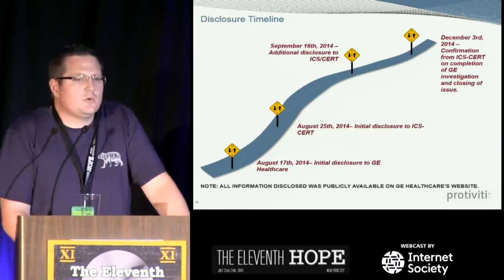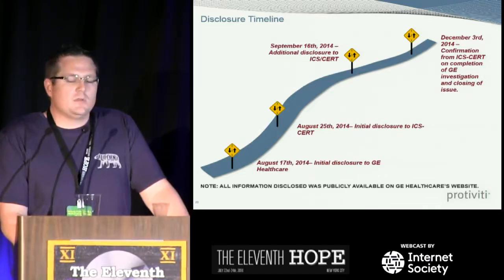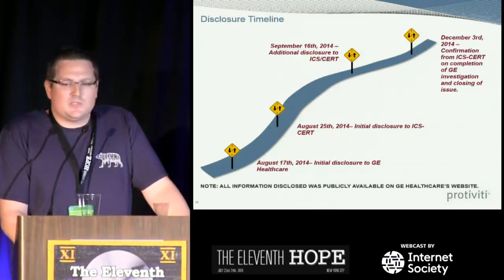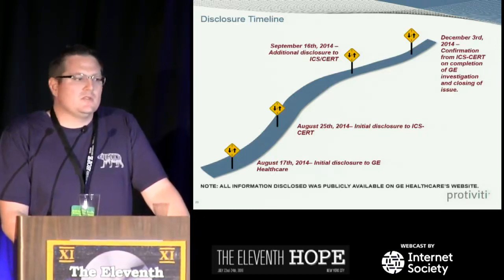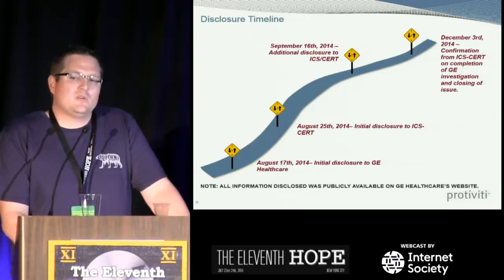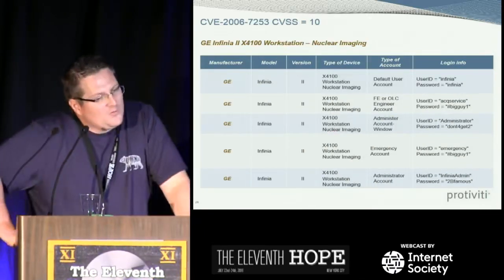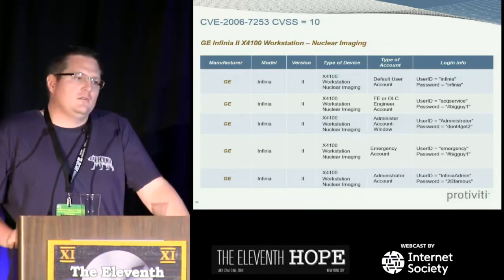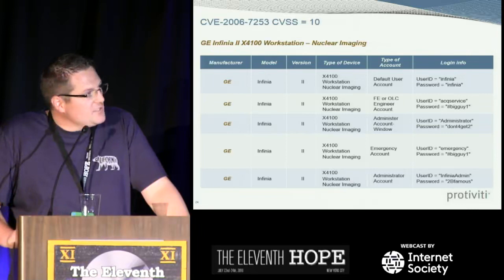And I think it's also very important to point out when we talk about this that although this is specific to GE, what I'm going to show you, this problem is not specific to GE. You see it across the industry. It's a systemic issue in healthcare and in medical devices. Historically, they were not designed or did not have security embedded during design or engineering. So here we go. I'm just going to do a subset, but overall, there's just over 30 CVEs for 150 sets of administrative remote credentials on systems. So this here will be followed, the CVE will start this, and then the CVSS score.